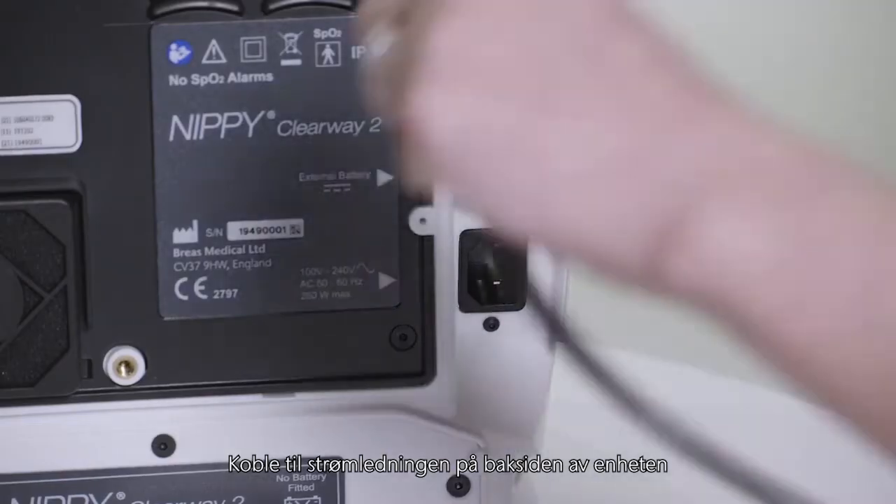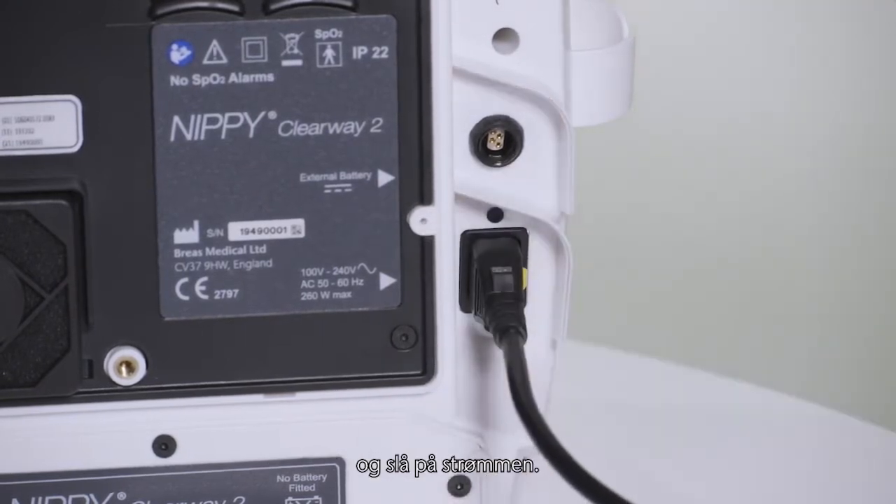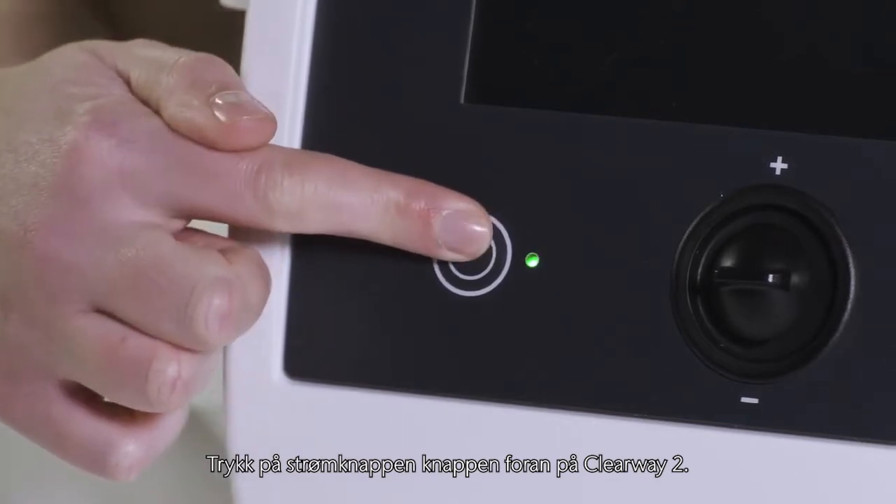Connect the mains power cable at the rear of the device and then connect it to the mains power socket and switch the power on. Press the power button on the front of the Clearway 2.